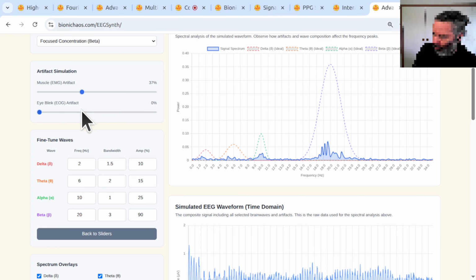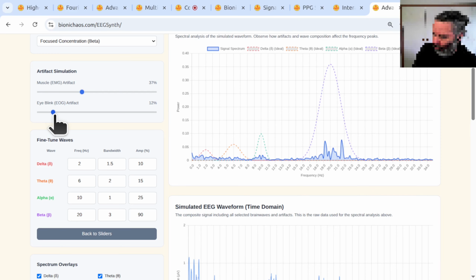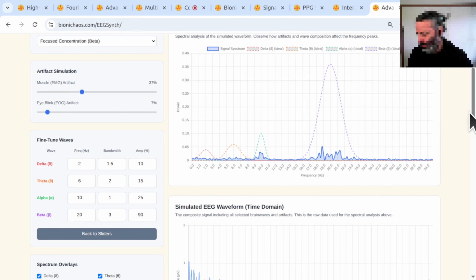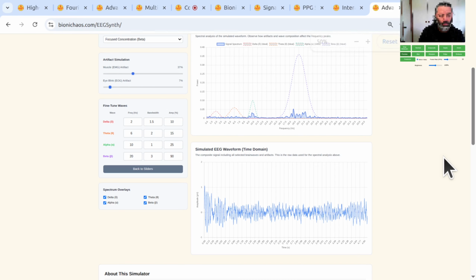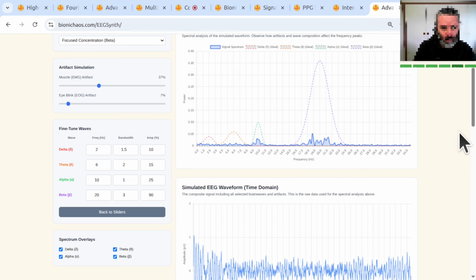Exactly those. They help us put a number on the complexity or roughness of the signal. Then, to actually sort these complex patterns, we use classification algorithms. Support vector machines, SVMs, are really common. They're good at finding the best boundary to separate different types of brain activity or states. Like telling apart different mental states? Potentially, yes. Or classifying seizure versus non-seizure data. And for grouping similar patterns without predefined labels, K-Means clustering is often used.